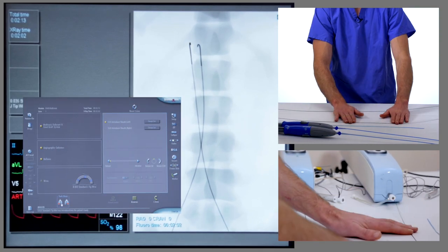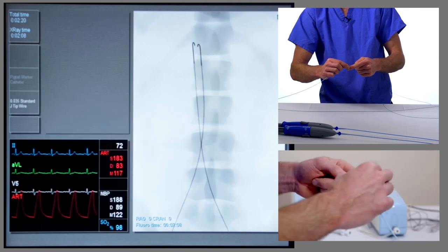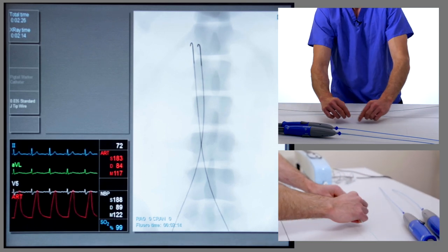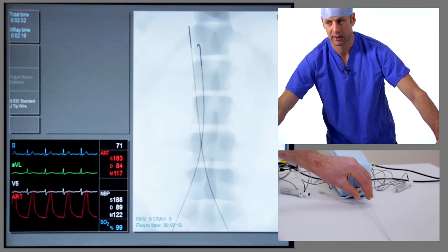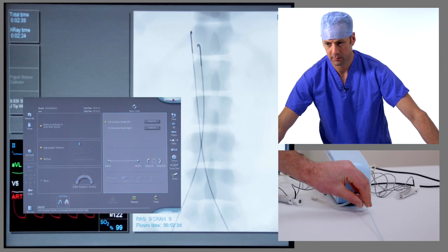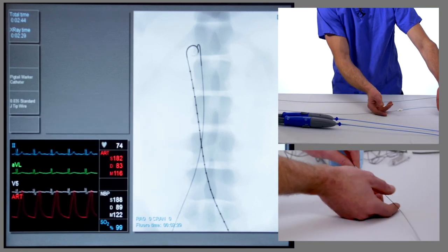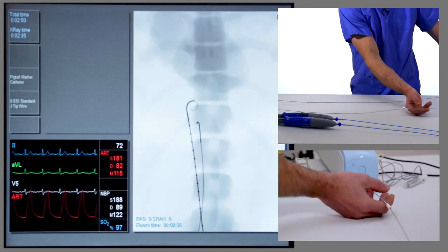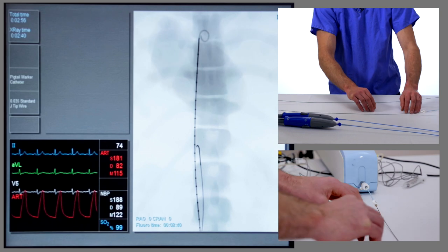We now need to change the left hand wire for a stiff wire capable of taking the Medtronic introduction system. To do that, we're going to pass a catheter over the J-tip wire — we'll use the pigtail catheter for this. We're placing the main body up the left hand side because the anatomy is better for a left main body introduction. We'll let the pigtail form and then advance the two together into the thoracic aorta. This is a very safe way of introducing a stiff guide wire.